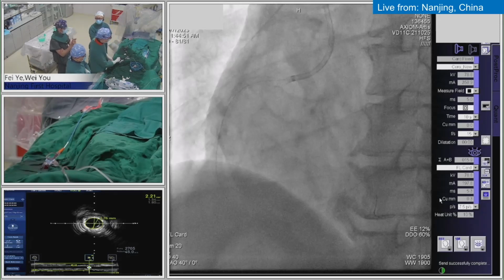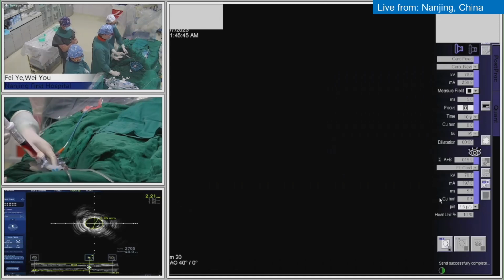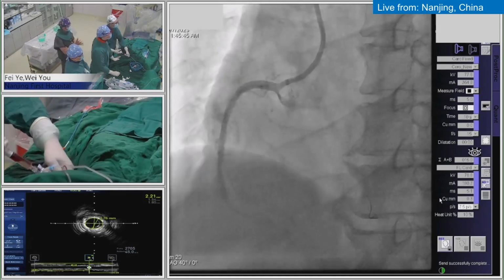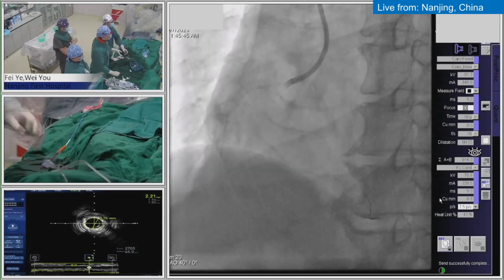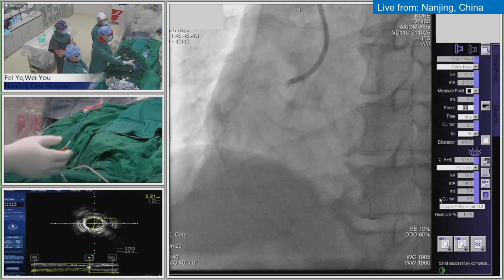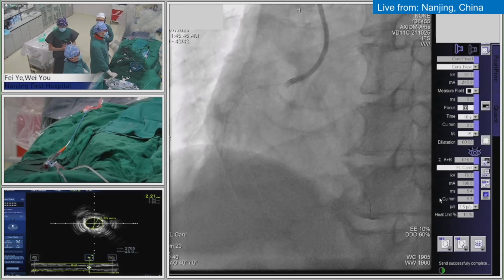For diffuse calcification, what should we do? We can use a lot of IVL balloons, but the rota is the best first choice. So the second is, after rota, is the 1.5 burr enough? We don't know. We should make use of debulking or modification for the calcification.